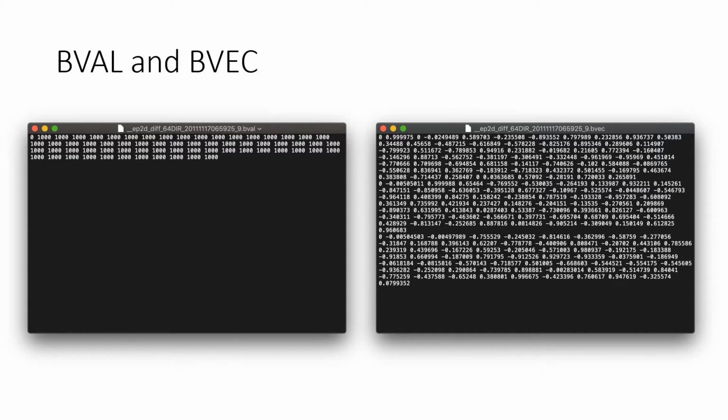And so what will often be done is we're going to acquire multiple b values. We'll have some zeros. We always want this background. We'll typically get a b1000, and then either 2000 as well, or a 3000, or 1000 and 3000.